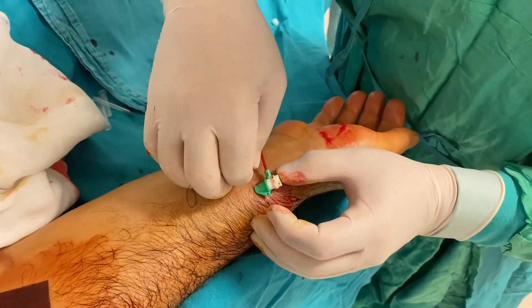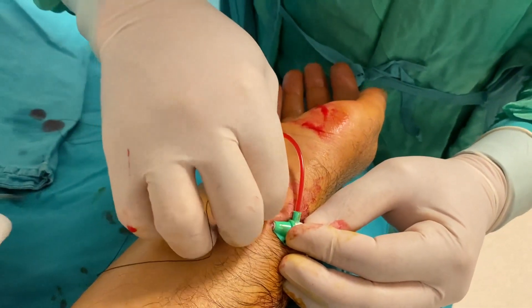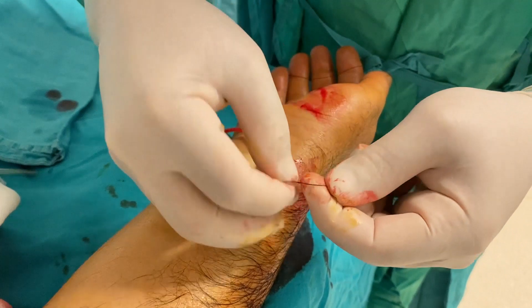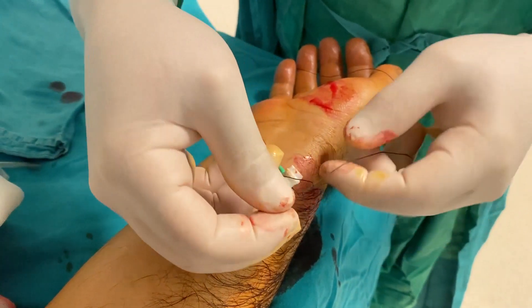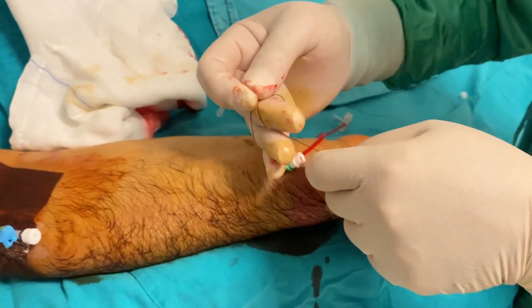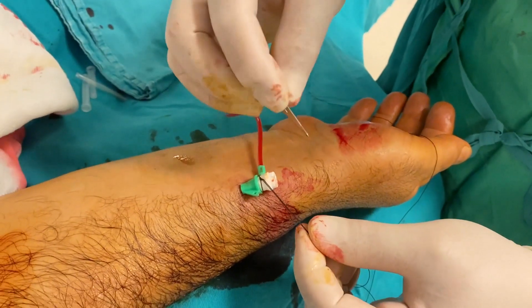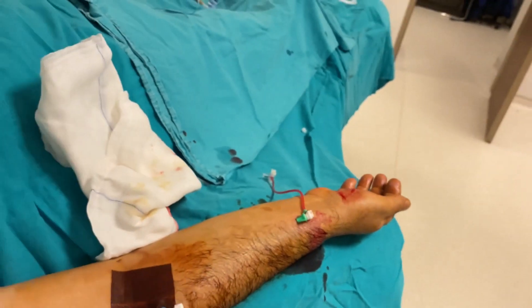Bunu güzelce yerine dikmemiz gerekiyor. Şu şekilde derinin altında biz bunu geçiyoruz, bunu bunun üstüne koyuyoruz, sonra bu şekilde çekiyoruz. Buna ipek diyoruz, bu sütür. Güzel sıkabilmek için üç kere bunu kendi içinden doluyoruz, sonra bunu buraya sıkıştırıyoruz. Sıkıştırdığımız zaman gevşemez; üç kere doladığınız için gevşemez ve sıkı olur. Sütürümüzü attık, artık bunu burada sabitleştirdik. Keserken keskin yerini yukarı buraya koyuyoruz; ipi getirerek kesiyoruz ki dokuya zarar vermiyoruz.